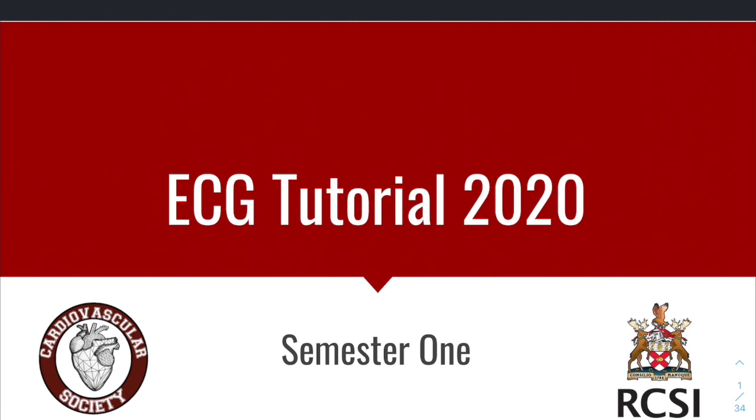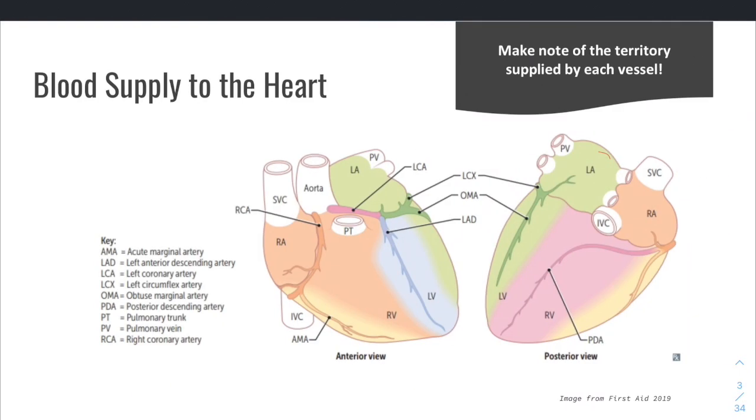Tonight, we hope to take you through some of the basics to making reading and interpreting ECGs easy, simple, and painless, and do a couple of examples so that you can apply these skills to some common ECGs that you may see, so that you can familiarize yourself with the systematic methodology to reading and interpreting ECGs wherever you come across them. So without further ado, thank you for coming tonight, and let's get started.